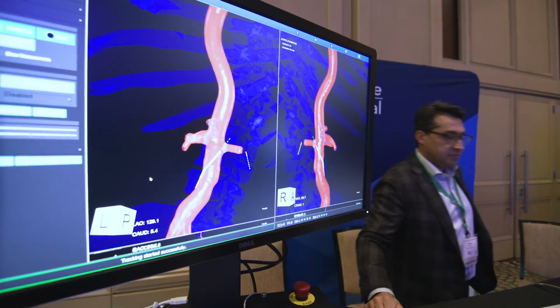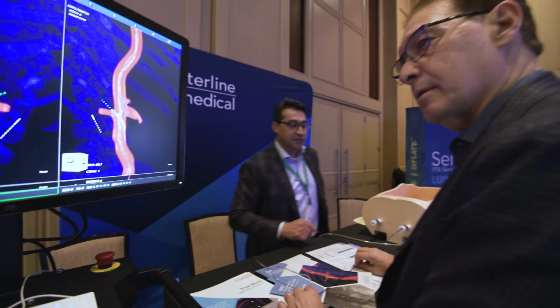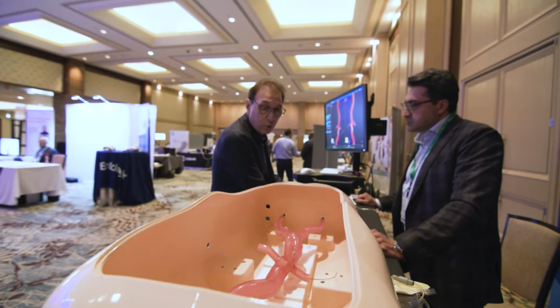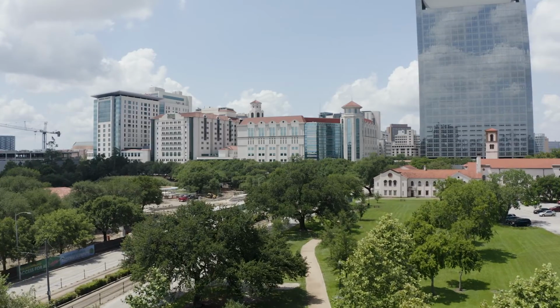So what about leaving X-ray behind altogether? We have already decreased fluoro X-ray time using other modalities, such as ultrasound as adjunctive imaging. But could another modality actually replace X-ray? Some of the new imaging modalities are important tools. It's early on in their evolution, but this idea of doing fluoroless navigation is certainly here. It needs to be expanded. It needs more catheters available for this, but the concepts have clearly been demonstrated.